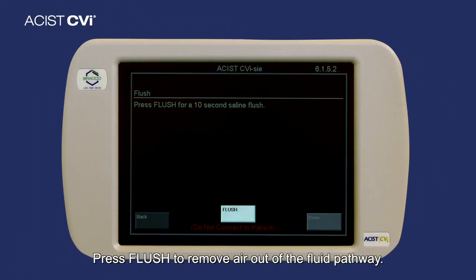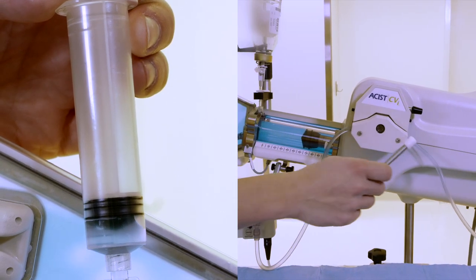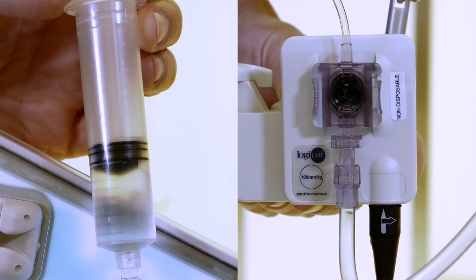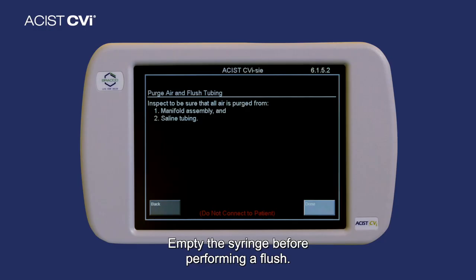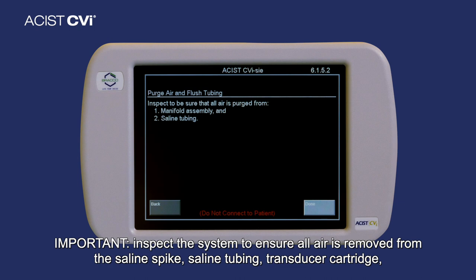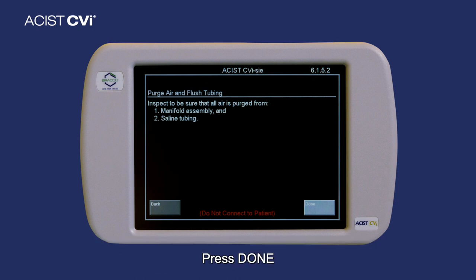Step 2. Press Flush to remove the air out of the fluid pathway. Repeat until all air is removed. Empty the syringe before performing a flush. Press Done. Important: inspect the system to ensure all air is removed from the saline spike, saline tubing, transducer cartridge, and manifold assembly before proceeding with the setup. Press Done.